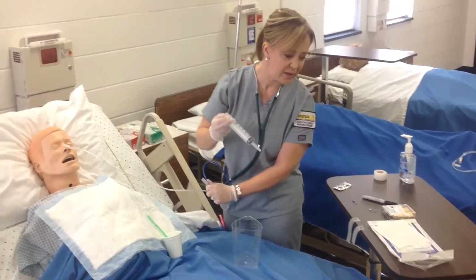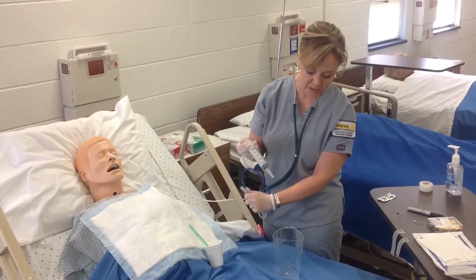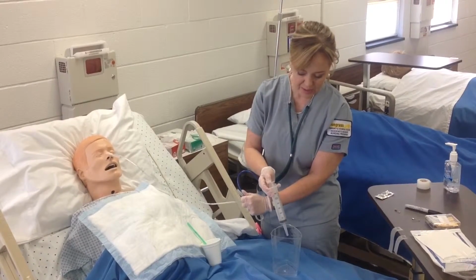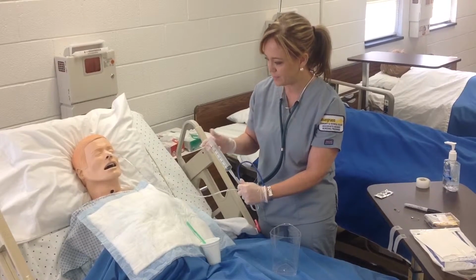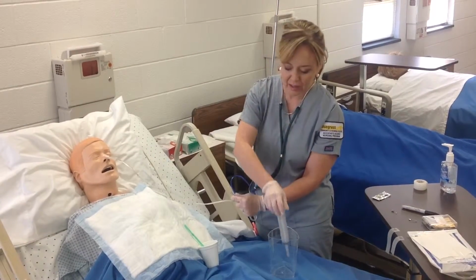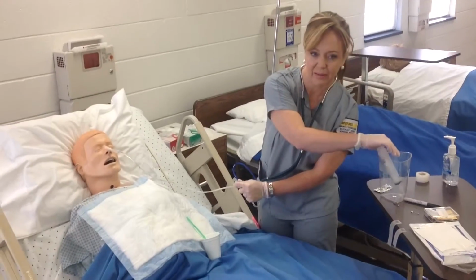All right, the pH is less than 4. The appearance of the aspirate is yellowish greenish, which is stomach level. So I'm going to put the stomach contents back in. Okay, and then at that point we're going to have an x-ray to ensure that the tube is placed correctly.